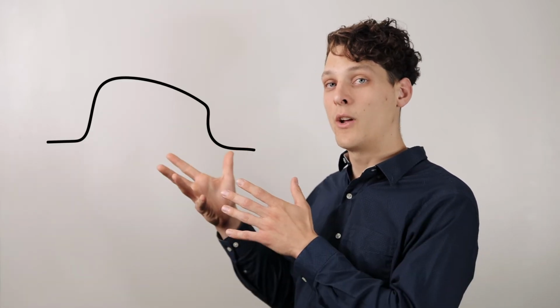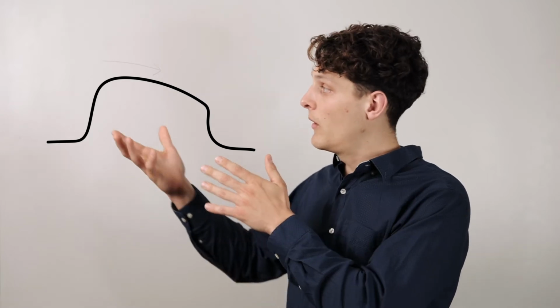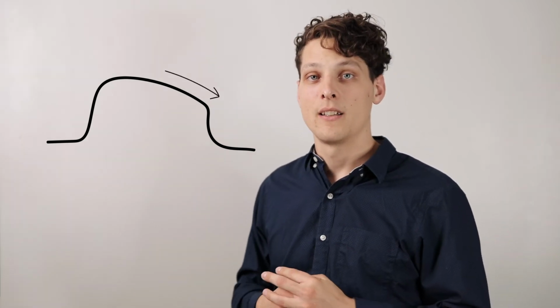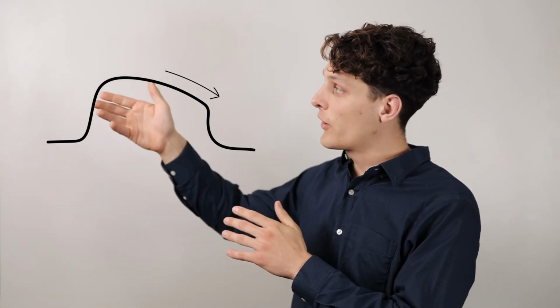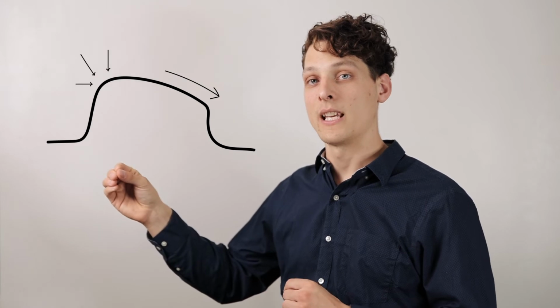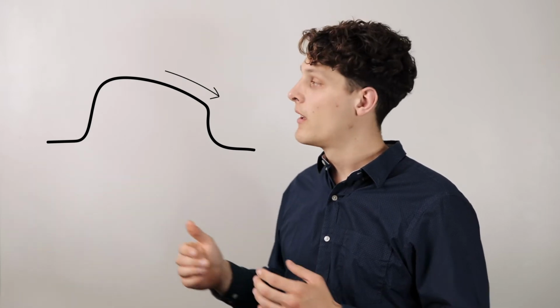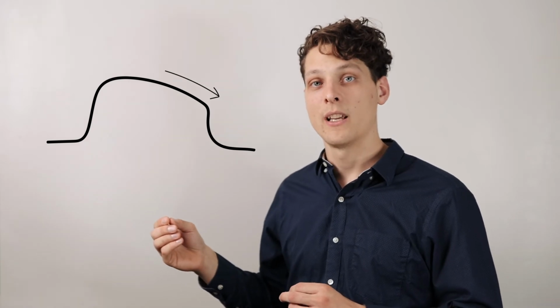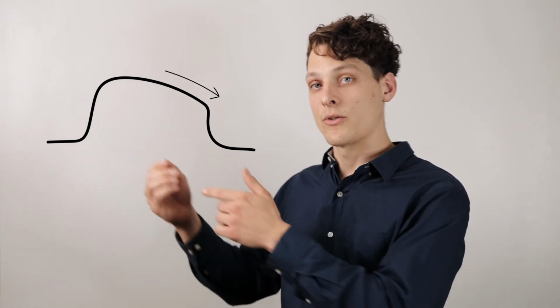In this graph, we have the exact opposite, with a downward slant resulting from excessively compliant lungs. At the start, there's a rapid diffusion of gas, which results in the peak value that we see. But at a certain point, there's a reversal of flow from the low concentrated ventilator tubing back to the patient, which results in dilution over time. Don't confuse this with a ventilator setup that supplies gas right next to the sampling site.